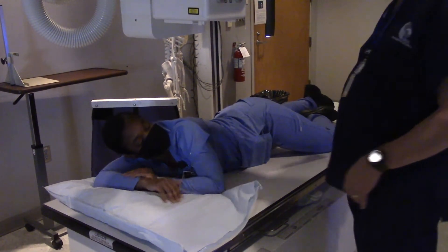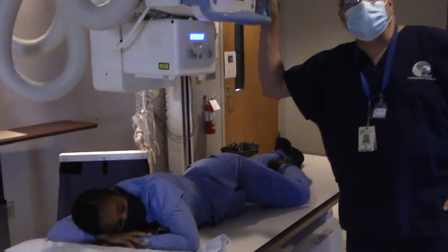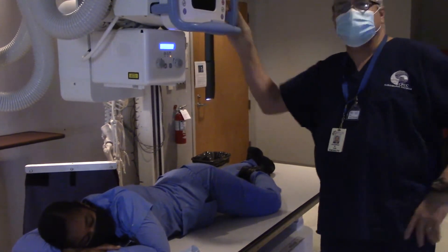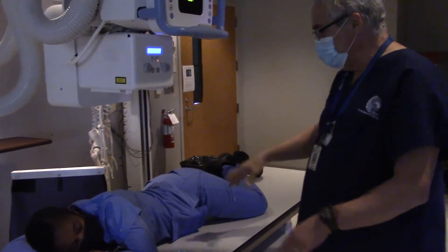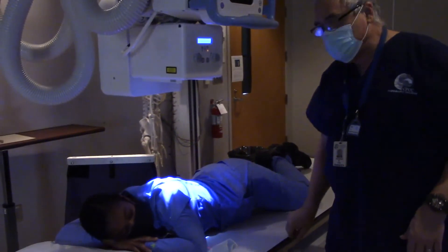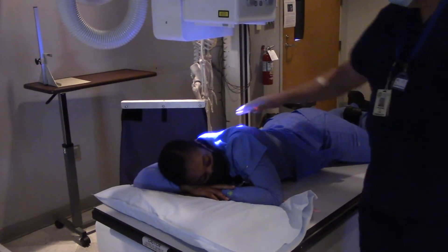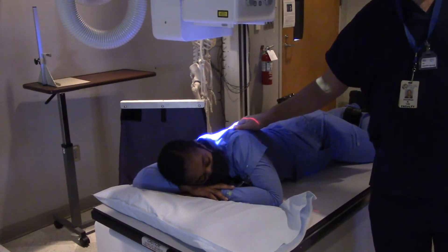There we go. Perfect. Now most of your patients aren't going to understand what a 35 degree obliquity is, so you'll just have to ask them to roll up and say, okay, right there's about good. Now where's my central ray supposed to be? I'll need my central ray to be at about the level of T6.